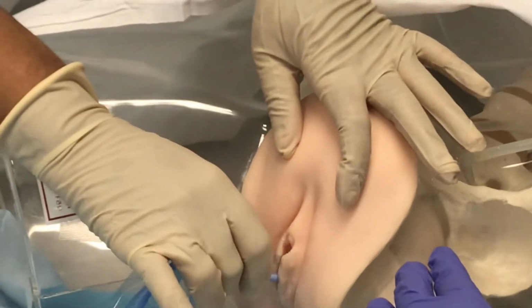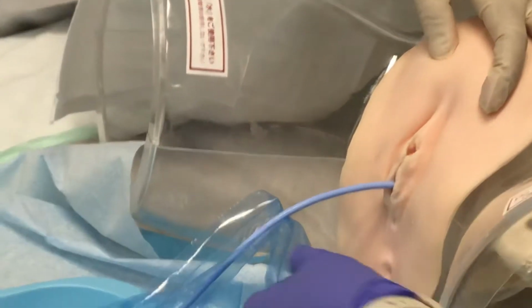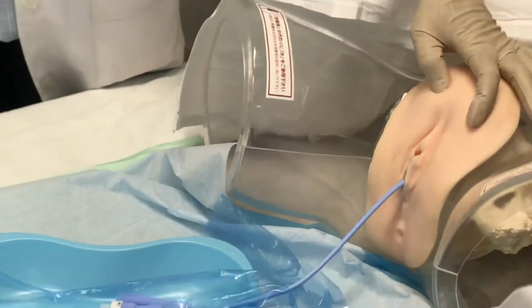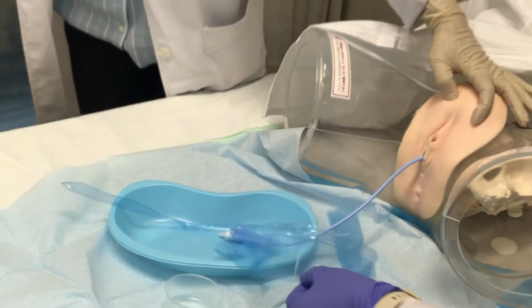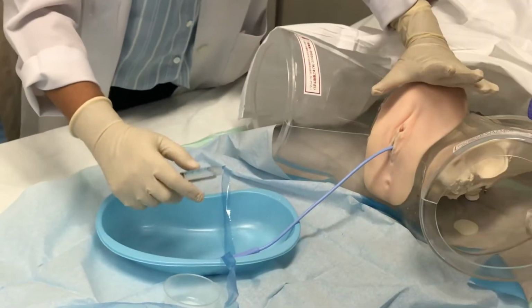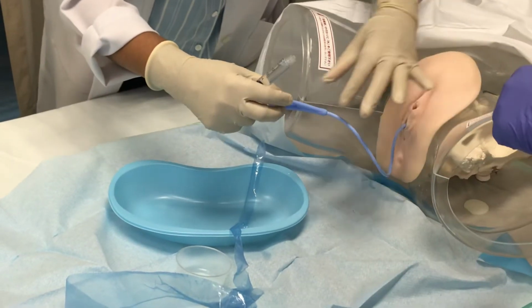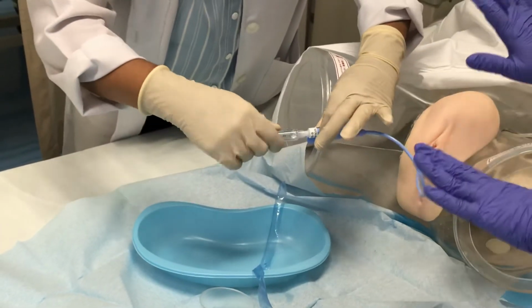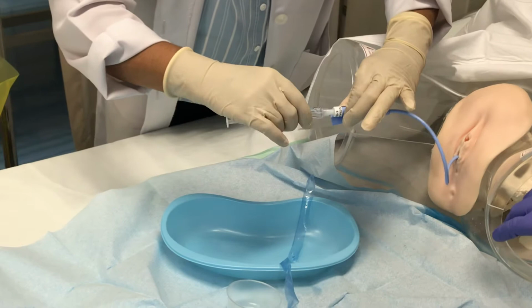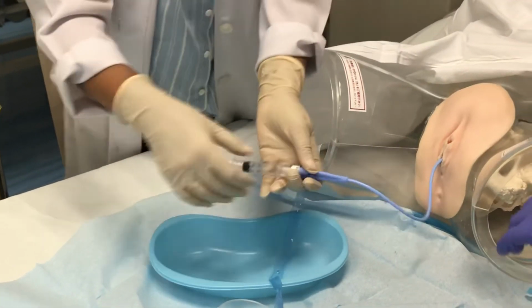Position, yeah, there is little only there. It's okay, no problem. No need to come back. So what is the next step is, I will use this hand. Again, I have not used my unsterile hand for this one. So again, it's okay now. This is the outside portion. Now nothing is going inside. She can be normal. And they can see.